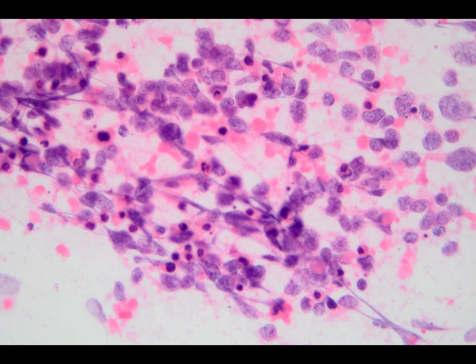The term small blue cell tumor is often used. However, in many cases, the tumor cells are not actually small. We do not measure the size of the nuclei in most cases. Rather, we compare the size of the tumor cell nuclei to background normal cells, such as a mature lymphocyte. A mature lymphocyte has an average nuclear diameter of 8 micrometers. Although there is no standard definition of a small cell, a mature lymphocyte can be used as an approximation for what is considered to be small.